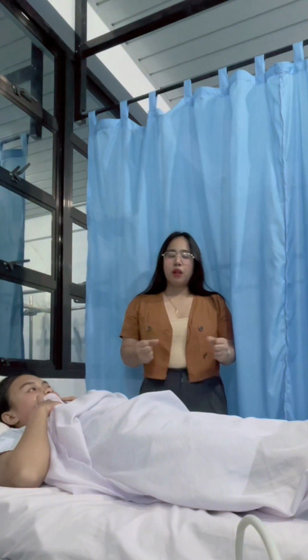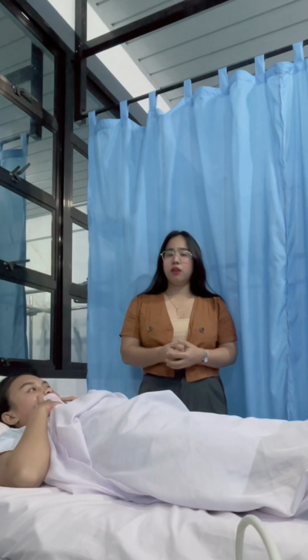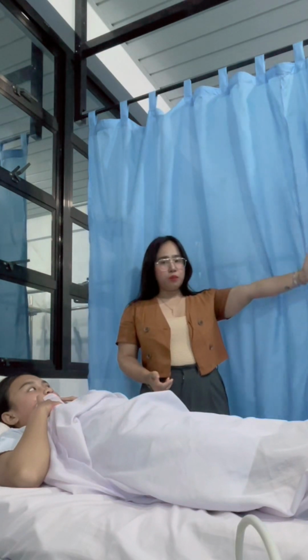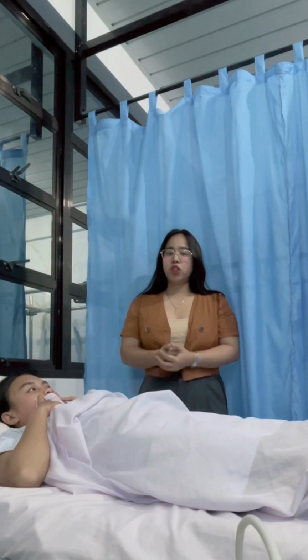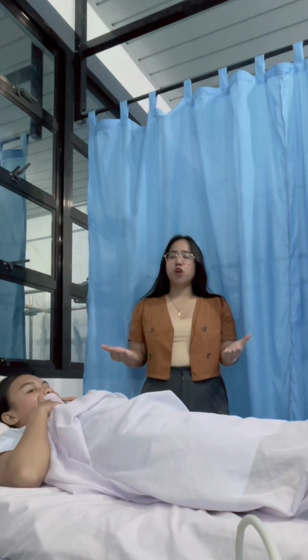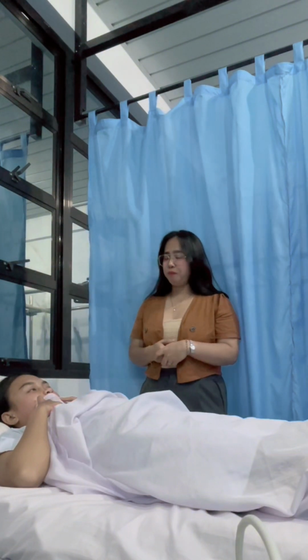And then perform hand hygiene, and let's assume that we have already done hand hygiene. Let's provide the patient privacy, and then put our patient in a comfortable or appropriate position, the supine position. And then next, let's observe or palpate and count the patient's respiratory rate.